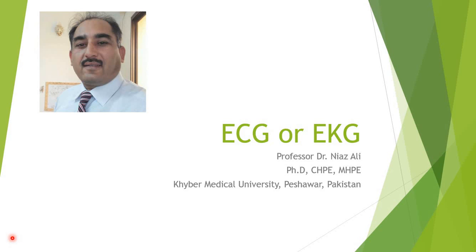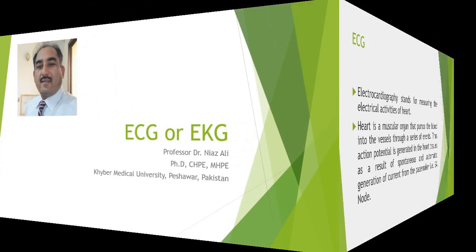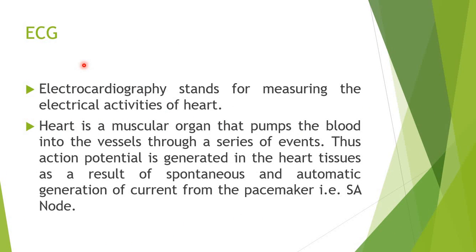We will be talking about electrocardiogram, ECG or EKG. Our main focus is on undergraduate students, rather students who are just beginners for ECG. Electrocardiography stands for measuring the electrical activities of the heart.